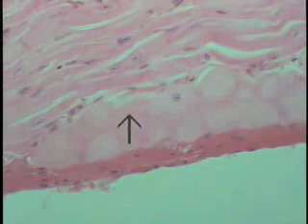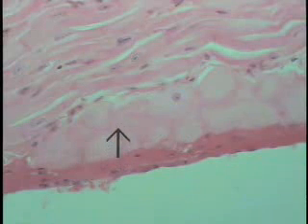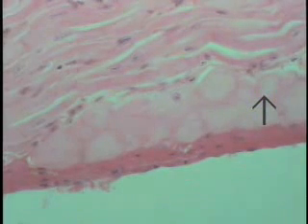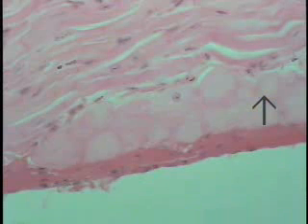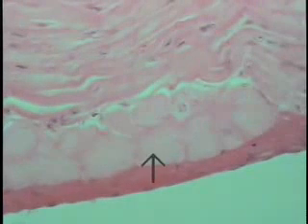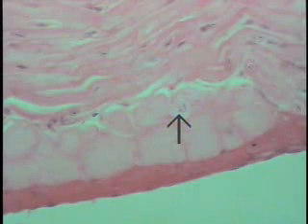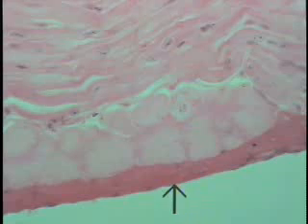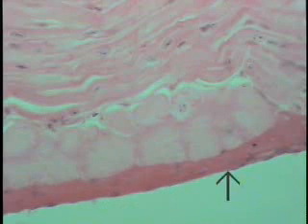So this is a cross-sectional profile of a bundle of Purkinje cells once again. The reason they're so light staining and sort of flocculent or fluffy in appearance is that these particular cells not only are large, but they're filled with a considerable amount of sarcoplasm, rich in glycogen, and they only show a few myofibrils that usually have a peripheral location within these cells. So these large cells, as indicated by the pointer and cut in cross-section in this case, are the Purkinje cells, most often found with greatest abundance within or just beneath the endocardium, which is shown here, and then you can see the endothelial cell nuclei lining this particular structure.